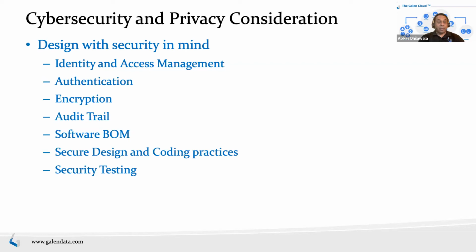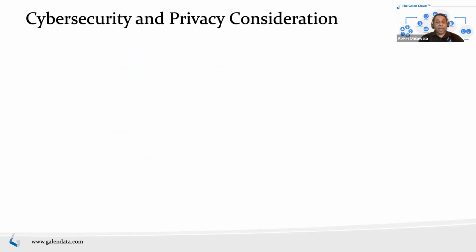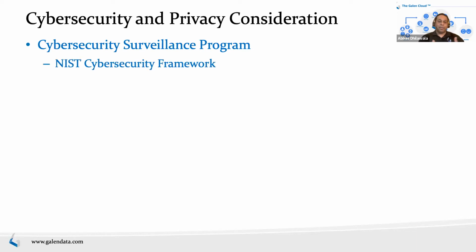So those are the things you want to design. And then setting up a surveillance program. As you move into operation, that surveillance program is important. Going back to NIST, NIST has a very cool tool called the cybersecurity framework. It essentially divides your entire process from a cybersecurity perspective into 5 phases. The first one is identify. This is what we talked about: risk assessment, identifying the vulnerabilities, prioritizing those.